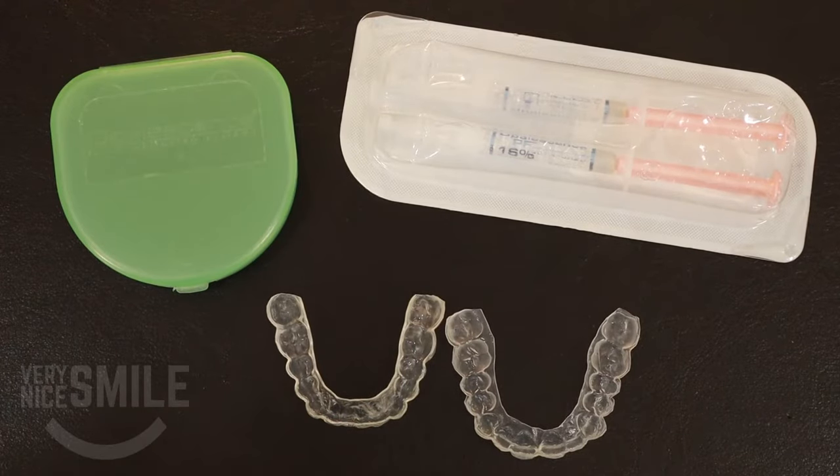Hey dental fans, Dr. Rich here, and today I'm going to show you how to use your custom whitening trays to bleach your teeth.